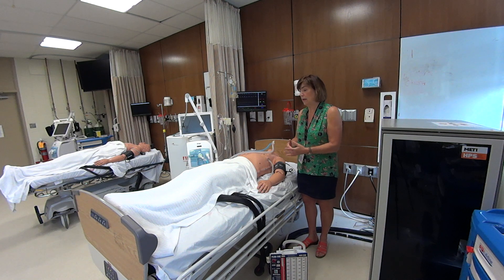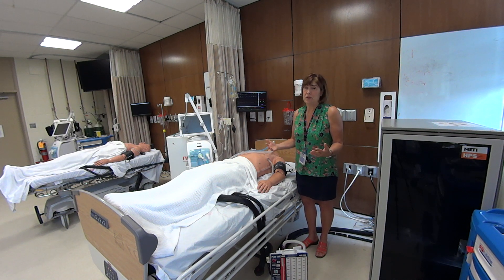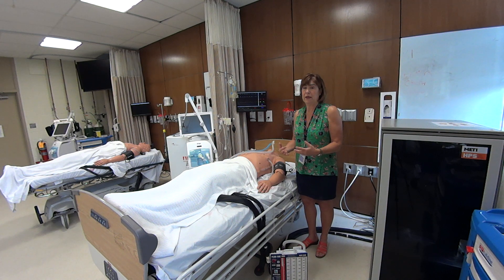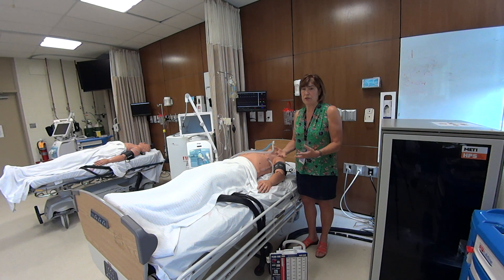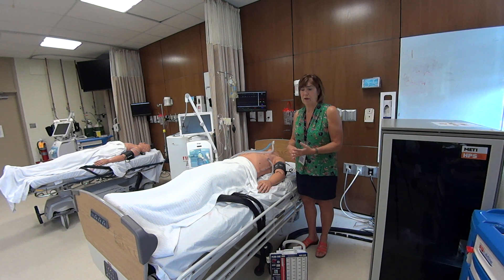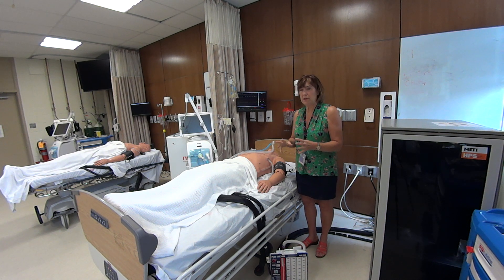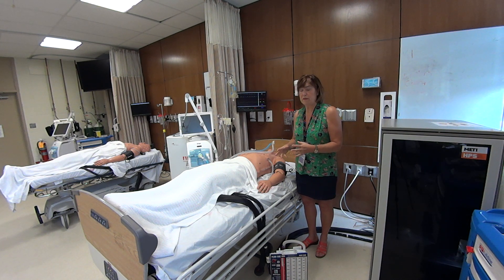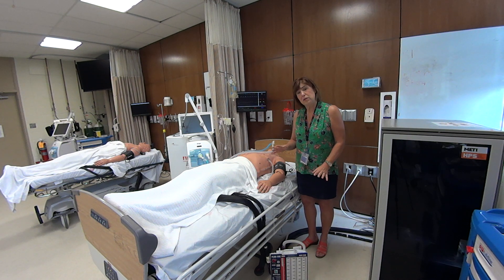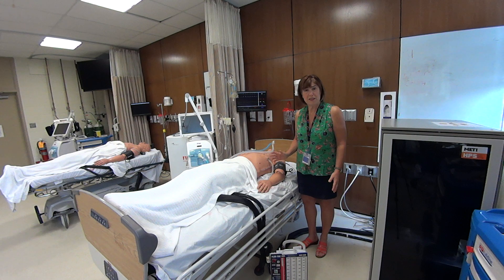The other thing we haven't set up here is that you'll often see a patient has a bag for urine, attached to a catheter going either into the bladder or into the penis. We need to be really careful with all of those pieces of equipment when we move a patient. Let's stop now and go look a little bit more closely at some of these things.